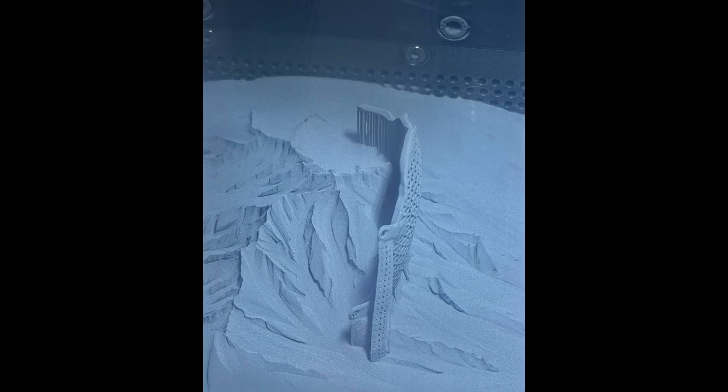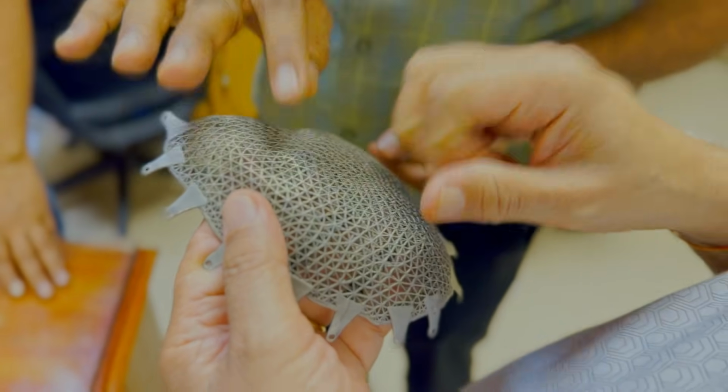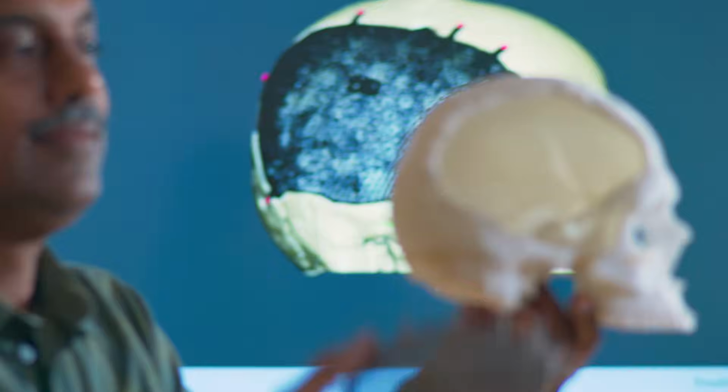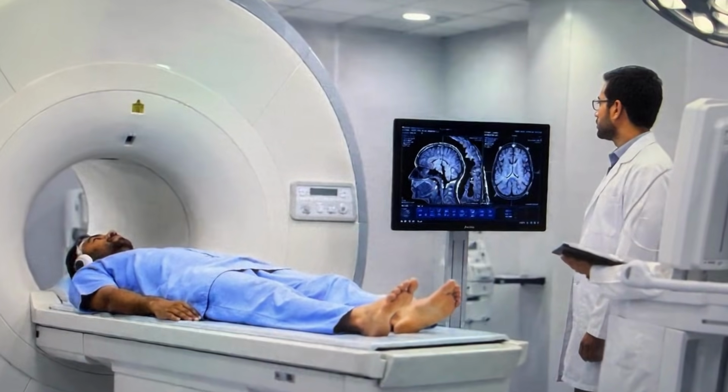Complex geometries that were once impossible now become routine by 3D printing. Production is faster, the fit is more accurate, surgical time is reduced. It is a new healthcare perspective. Personalized, lightweight, biologically intelligent. Made possible by the meeting of advanced manufacturing and human anatomy.